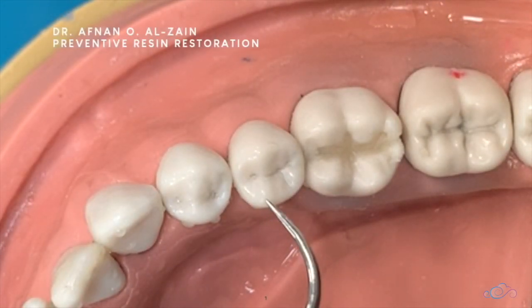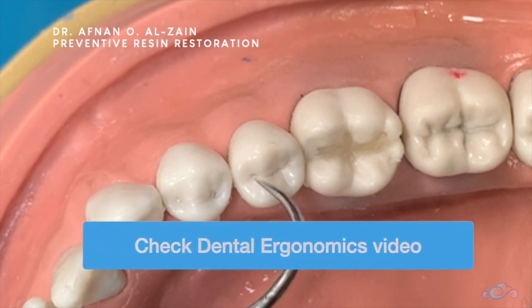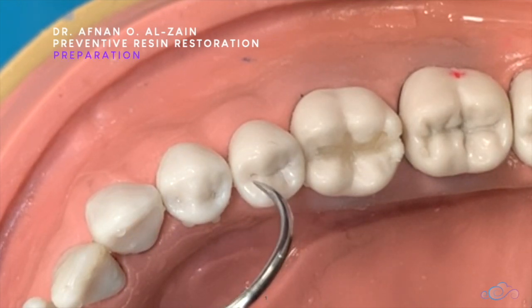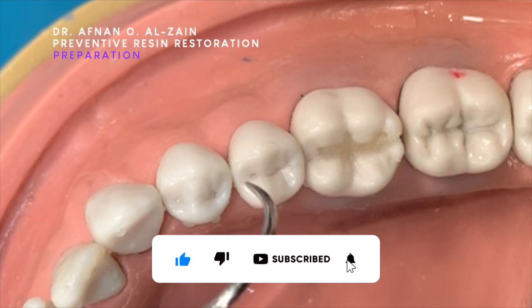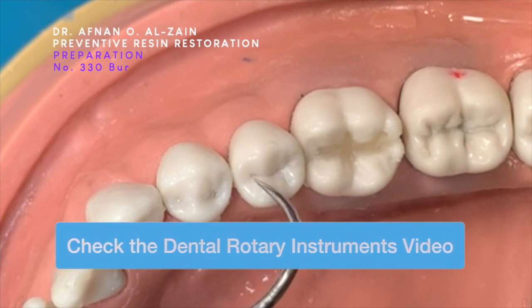In this video we're going to do a PRR restoration. We're going to create a small cavity — there is a caries, just a pit — then in the rest of the grooves we're going to apply fissure sealant. The first thing we're going to do is create this cavity using a 330 burr to a 1.5mm depth.